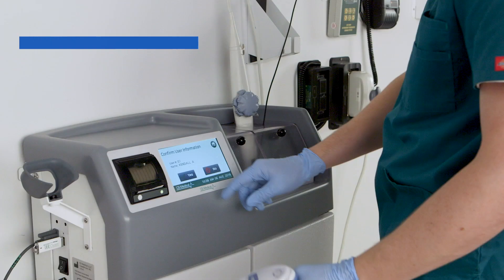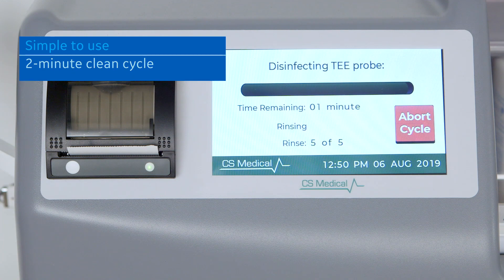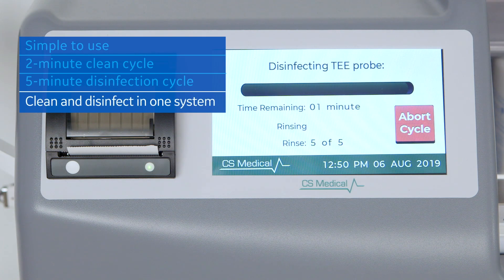T-Clean is simple to use. The quick two-minute clean cycle combined with a five-minute high-level disinfection cycle means the cleaning and disinfection process can be completed with one system.